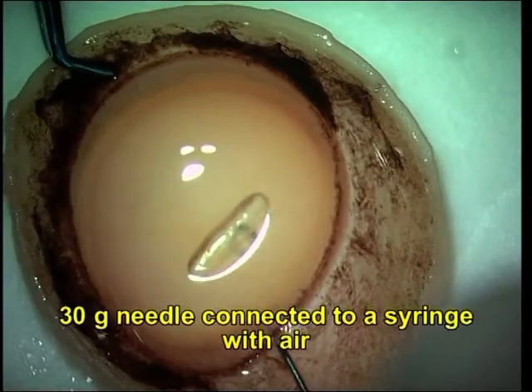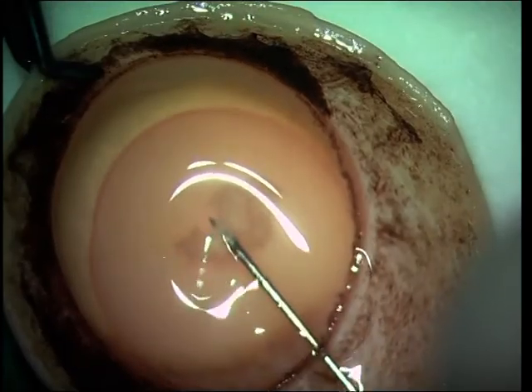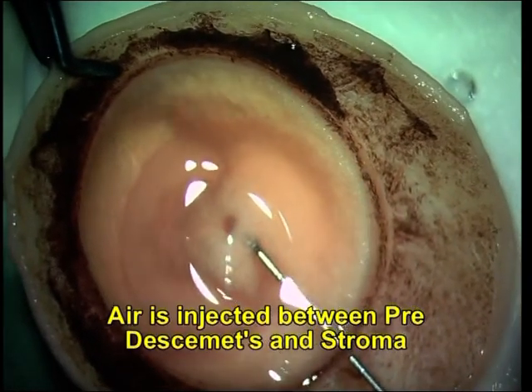The donor corneoscleral button is prepared with the endothelial side up. A 30-gauge needle filled with air is injected in a superficial plane between the pre-Descemet's layer and the stroma.